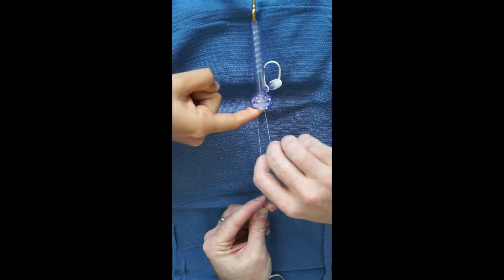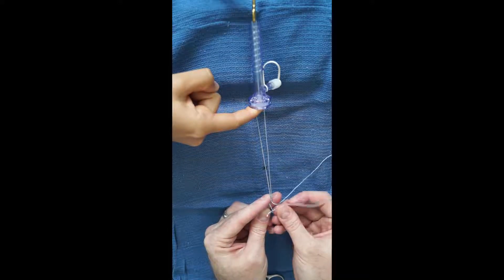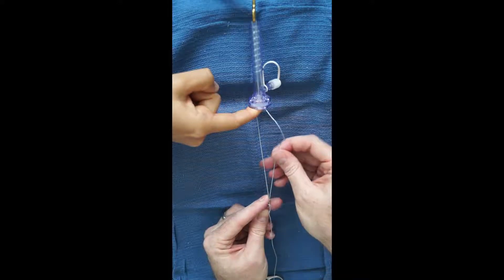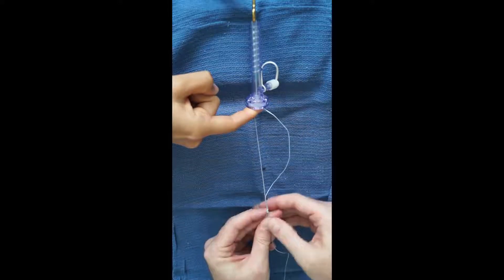A knot pusher can also be used to facilitate guiding the knot into place. Pulling the post will help cinch down the knot more firmly to the desired tissue. Once adequate tension has been obtained, the non-post free end is pulled in line in addition to the post limb to lock the knot down.